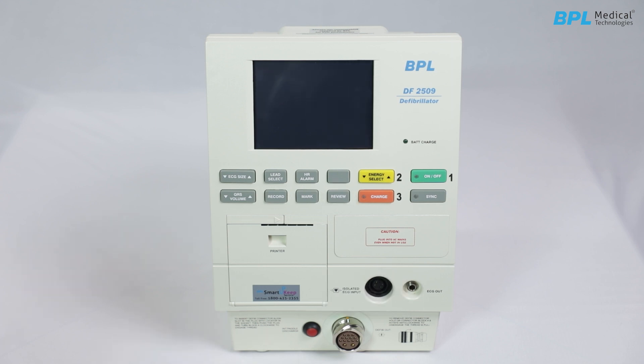The isolated ECG input and ECG output connector provides output for external monitoring.